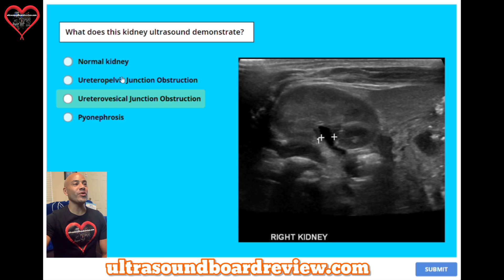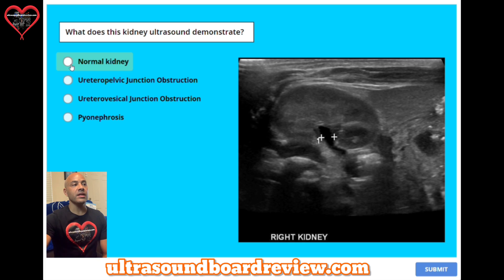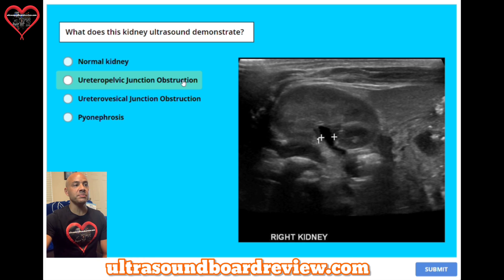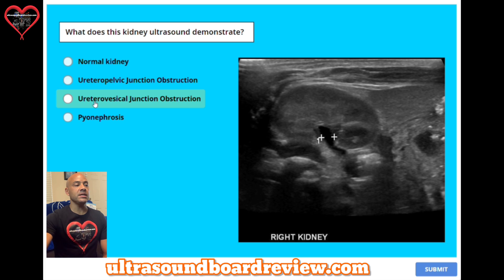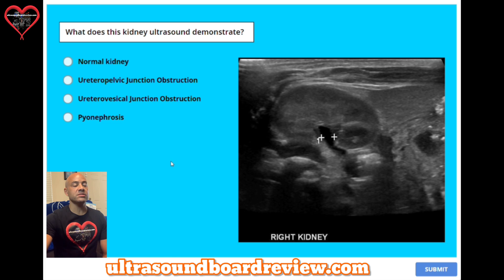Question 46. What does this kidney ultrasound demonstrate? A: normal kidney. B: ureteropelvic junction obstruction. C: ureterovesical junction obstruction. Or D: pyonephrosis.